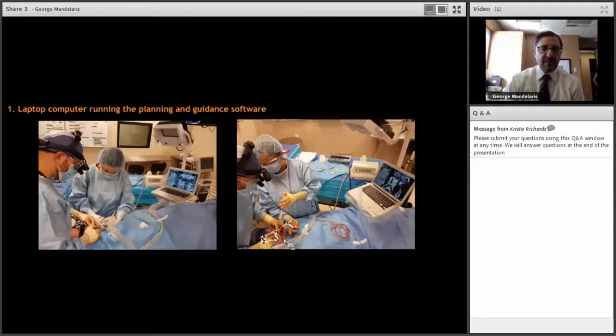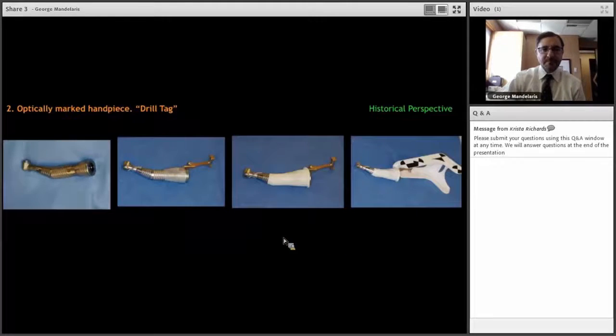But as we'll share with you a little later on, we have a recent article that's been submitted to JOMI that the accuracy of this technology is as accurate as totally guided implant surgery, if not even more accurate. So the data is emerging and it's getting there. It does take a little getting used to because I'm looking at a computer screen to execute the surgery. So there is a transfer of trust in the technology and in the execution, just like there would be in any other type of modality.